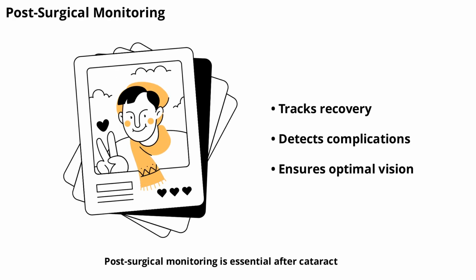Post-surgical monitoring is essential after cataract surgery to track recovery and detect complications. The doctor performs regular exams and tests to ensure proper healing and optimal vision. Monitoring includes visual acuity, eye pressure, and imaging. Post-surgical care supports long-term eye health and successful outcomes.